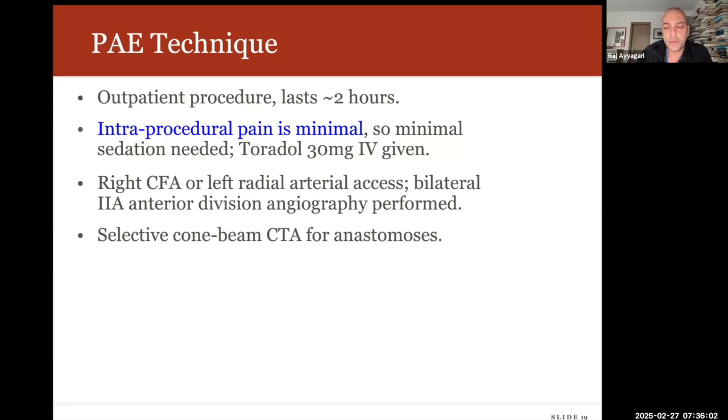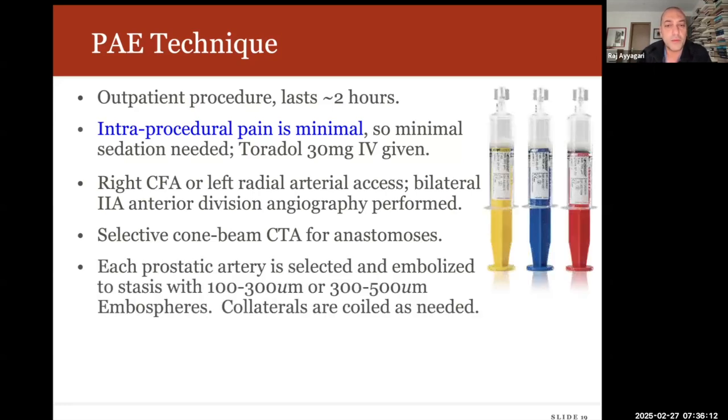I don't know if your angiography suites can do cone beam CT. I don't really bother with that. It's very, very rare that I do that. So if we don't have that, I wouldn't consider that a problem. Oh, they have it, probably. Oh, excellent. Okay. So maybe we'll do that a lot anyway, even if it's not necessarily required.